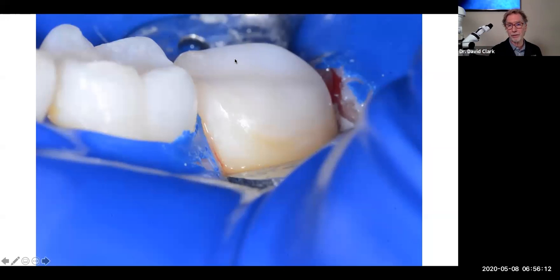You might get a little bit of function over on this mesiobuccal cusp over time, but we've got to buy time for this tooth to let it heal, to let the pulp grow, to let the tooth fully erupt. You know, 20, 30 years from now, I hope we could think about something that would have maybe more aesthetics and contribute a little bit better to coupling of the teeth. But I'm proud of this tooth, and I wouldn't do it any differently today. I mean, I barely survived as it was. That was a tough tooth, you know?